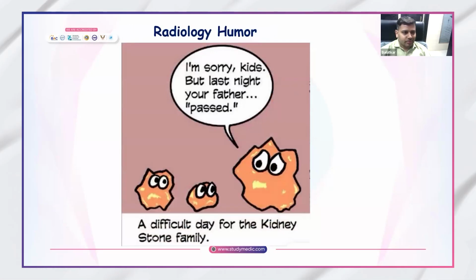So in brief, we talked about the ultrasound examination of the kidneys, their common pathologies, and the normal appearance of the kidneys on ultrasound examination. We will be discussing all these topics in great detail in our course.